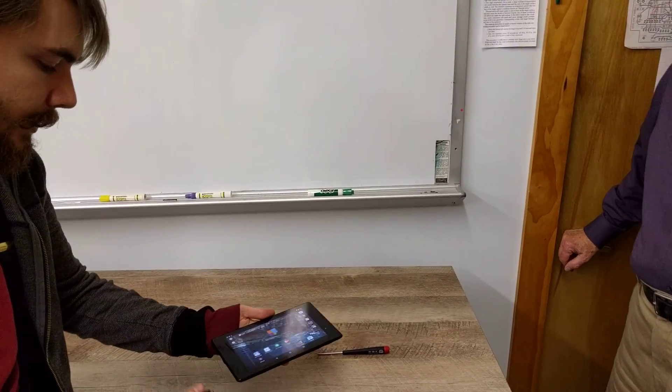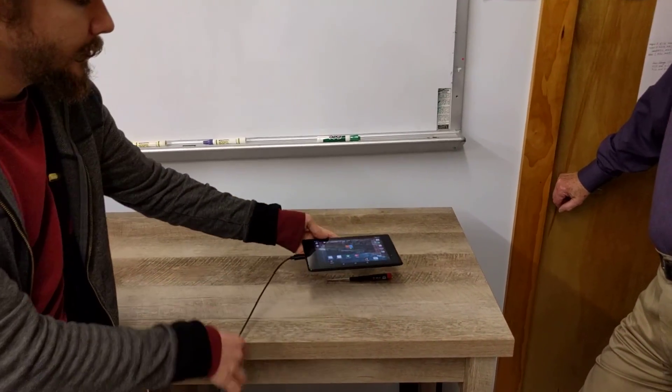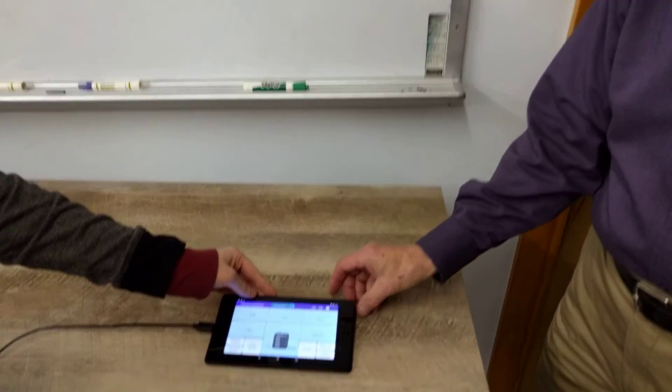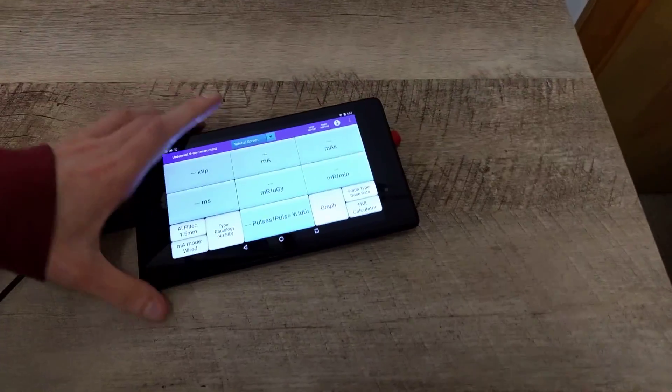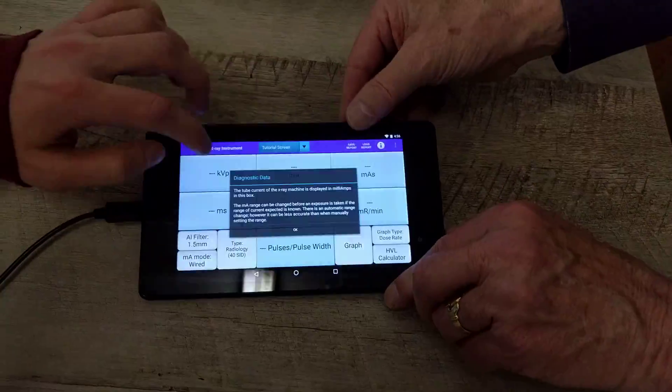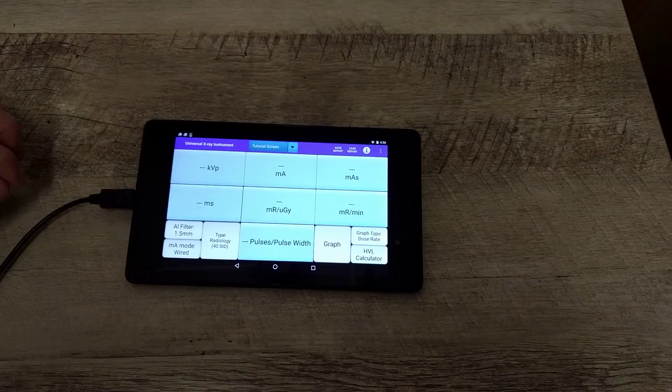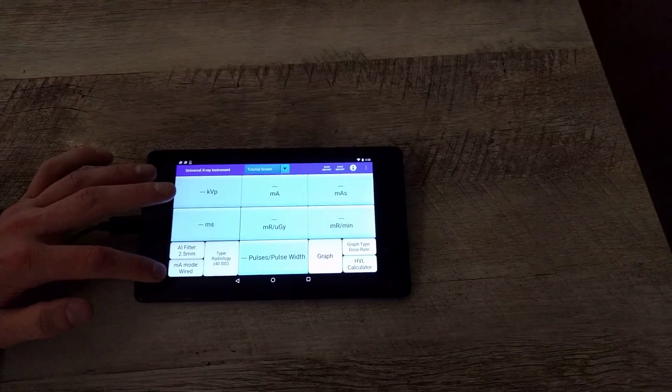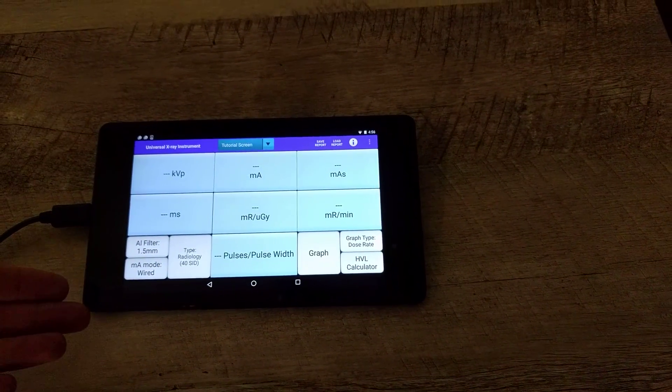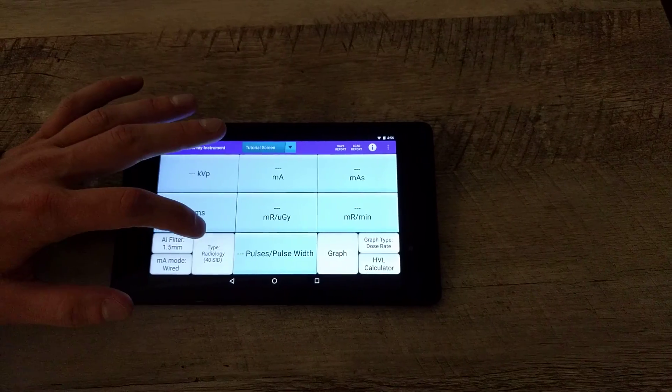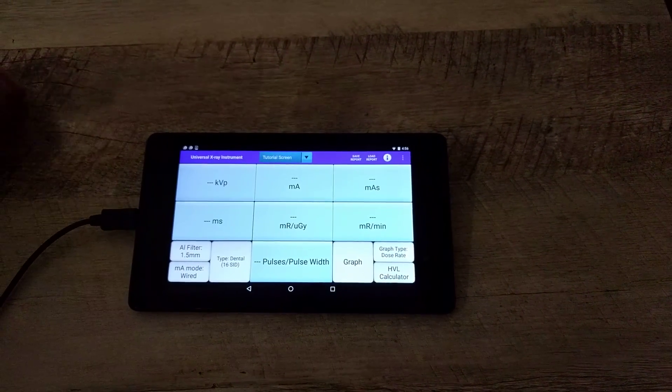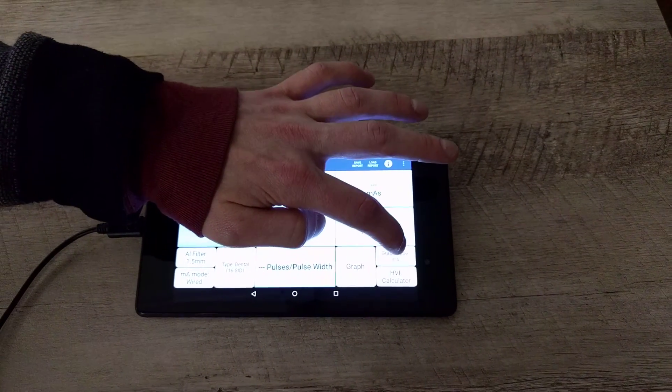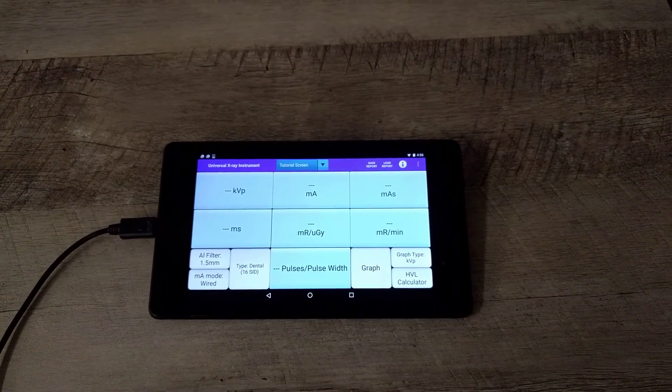The app should automatically come up and here you can tap any window to get a description of what it represents. You can tap here to change the filtration of aluminum, you can tap here to change wired mode and current mode for the MA, and here to switch between dental and radiology. Right within here to change the type of graph that you want to record. Okay, we are taking a dental type X-ray.